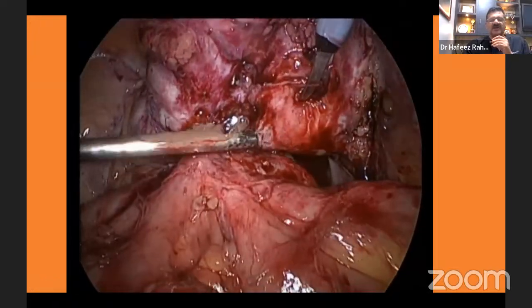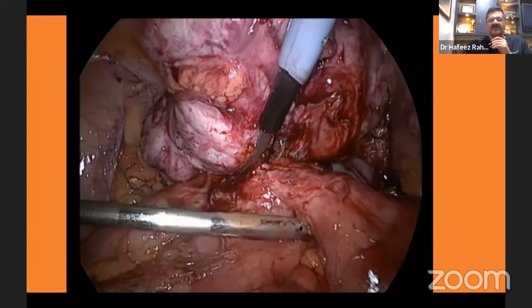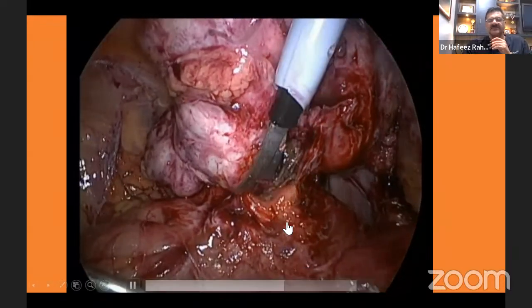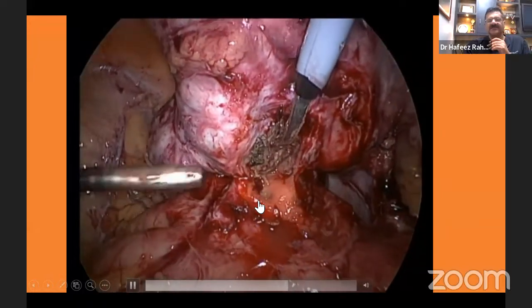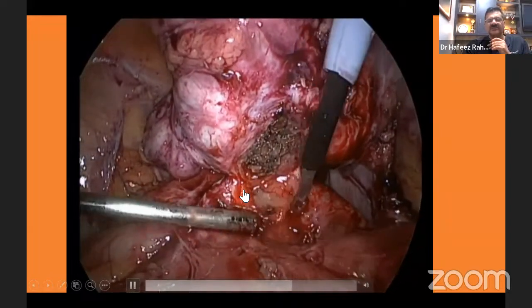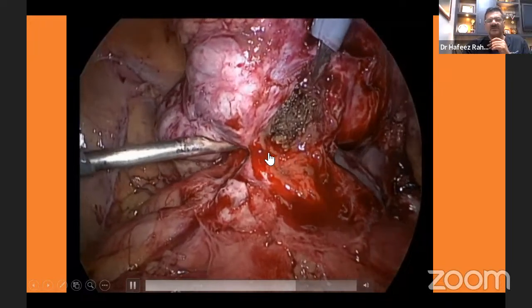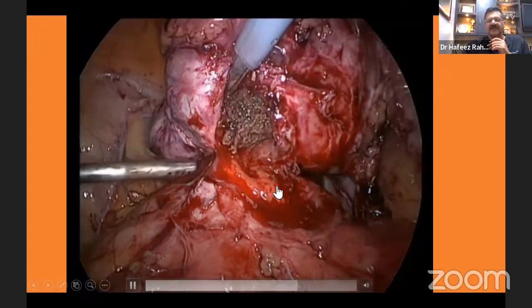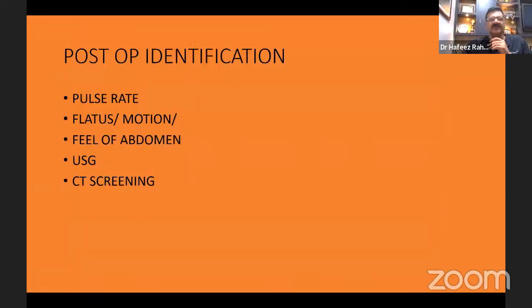These are important things to understand. It can be classified as a complication, but it's not really a complication. It's actually a part of the disease. You can see the bowel mucosa very nicely here. Can you see that? This is opening right into the ovaries. So this is not actually an injury. You can see the mucosa formed around it. So you have to excise this mucosa completely and then do the repair of these kind of fistula.